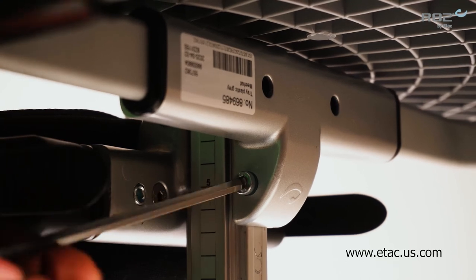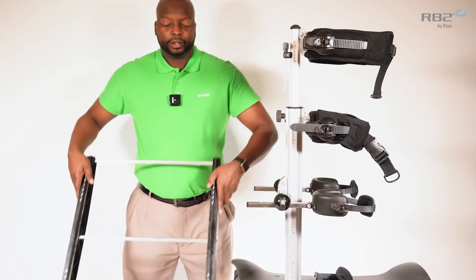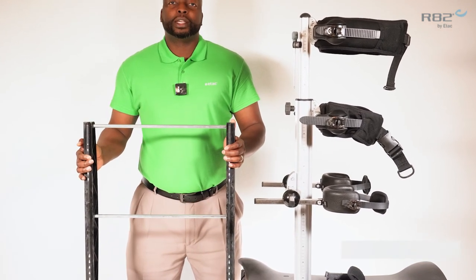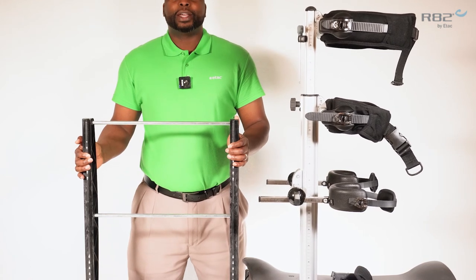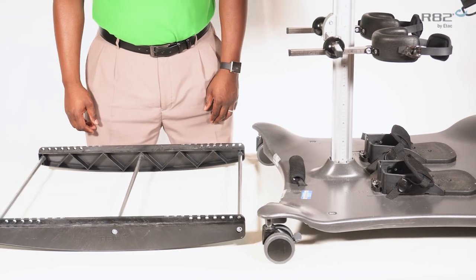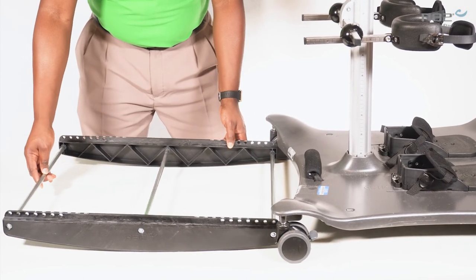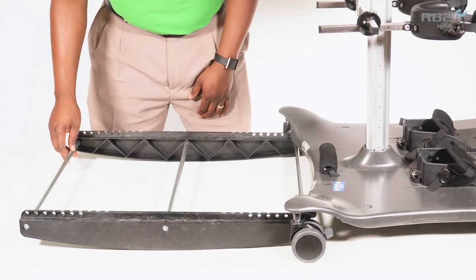One of the most unique features of the Meerkat is the use of the rocker. The Meerkat easily converts from a static stander to a dynamic stander. To insert the rocker into the base plate of the Meerkat, you must first align the rocker with the rear of the base plate.